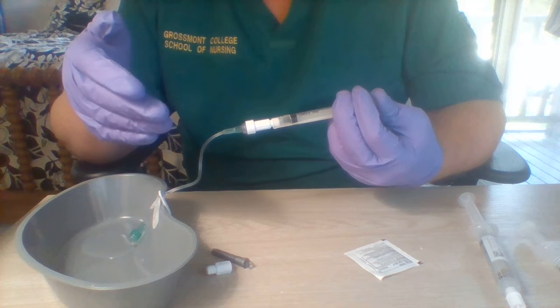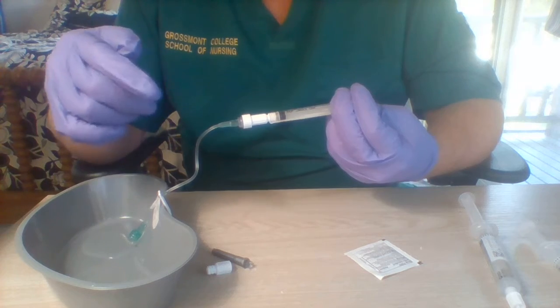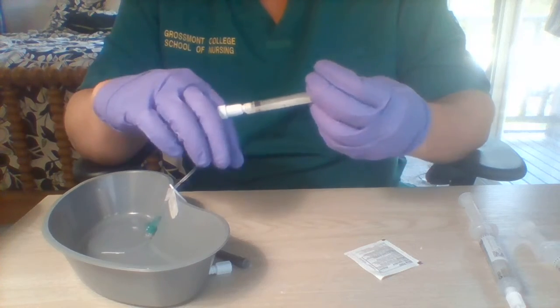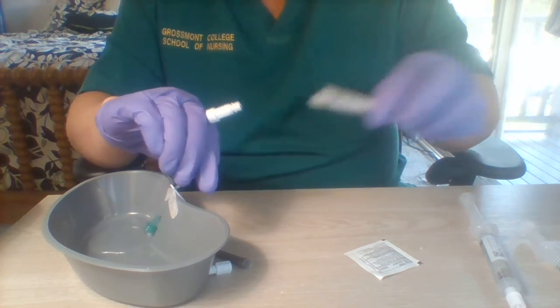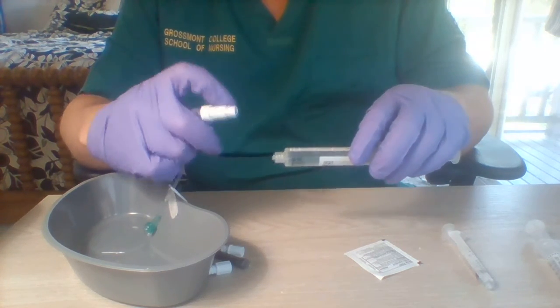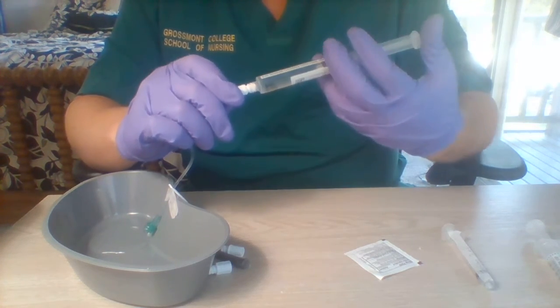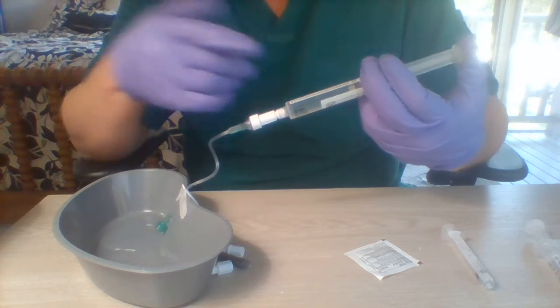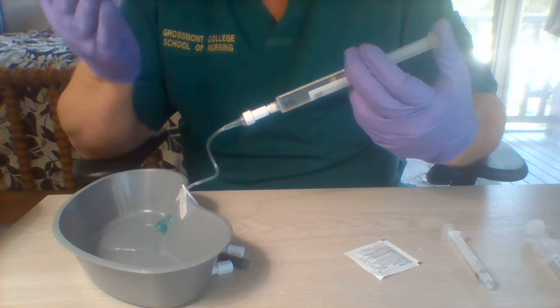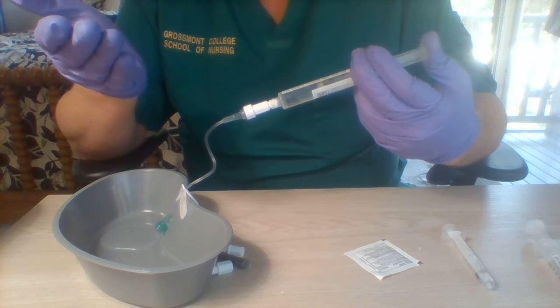30 seconds is up. We will administer the last 0.5 mLs. So there's no more in the syringe, but there's still some in here. So we detach the syringe, attach a new flush, 30 seconds has passed, and we will inject 0.5 mLs. But since this is the last dose, I can flush it with 5 mLs or the whole flush if I want.